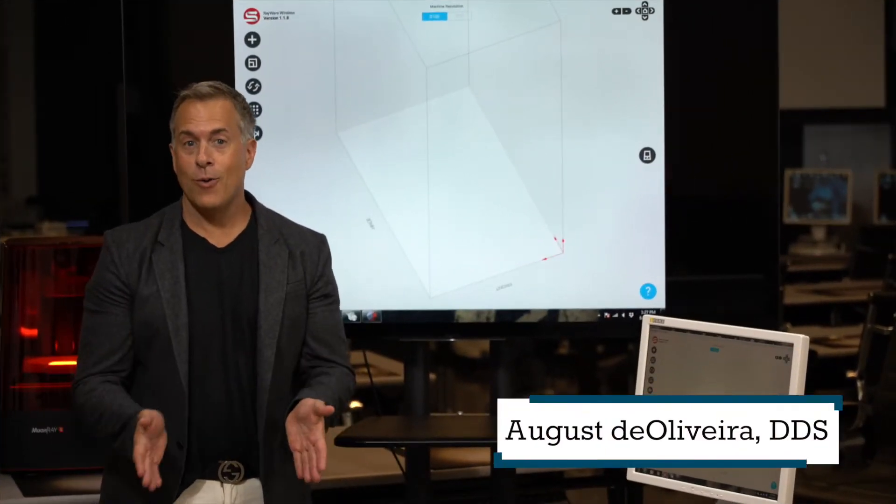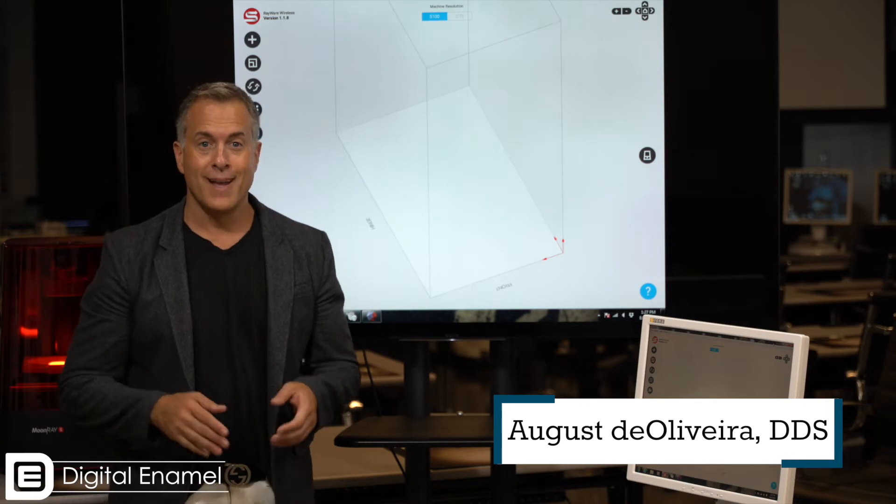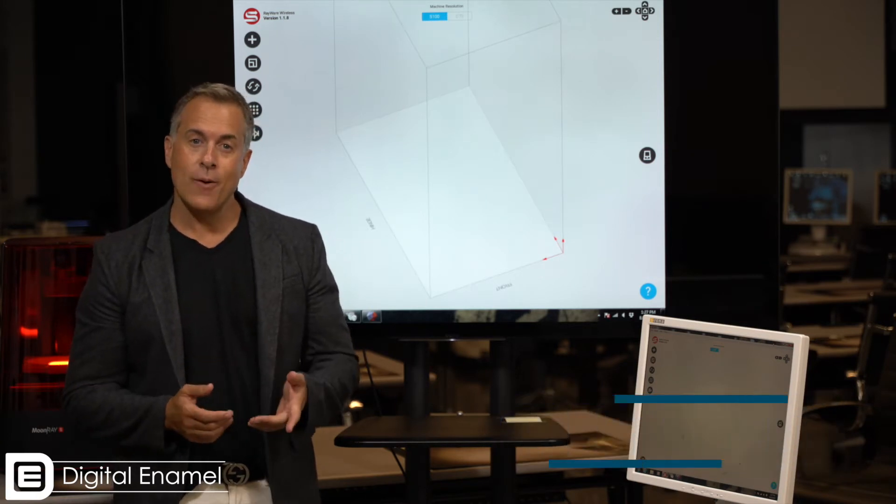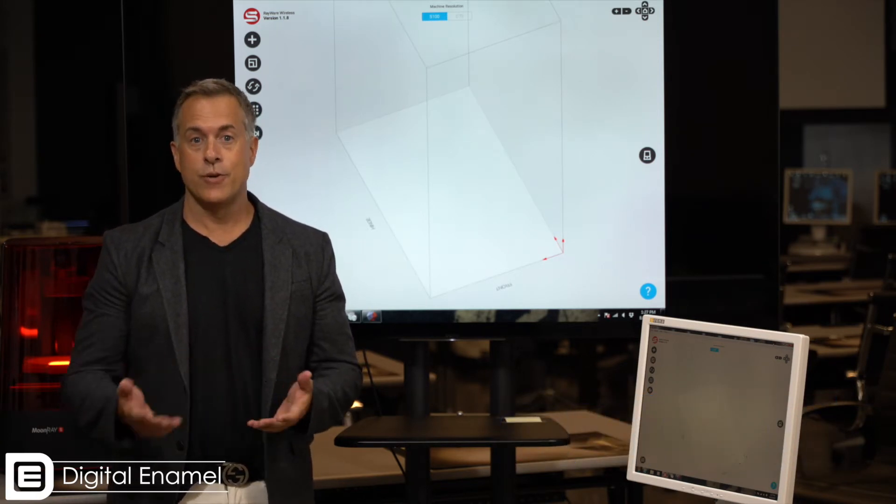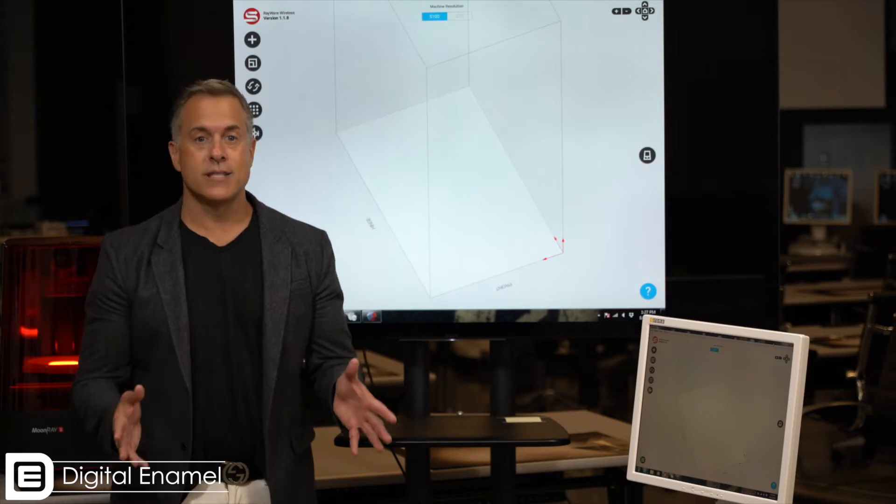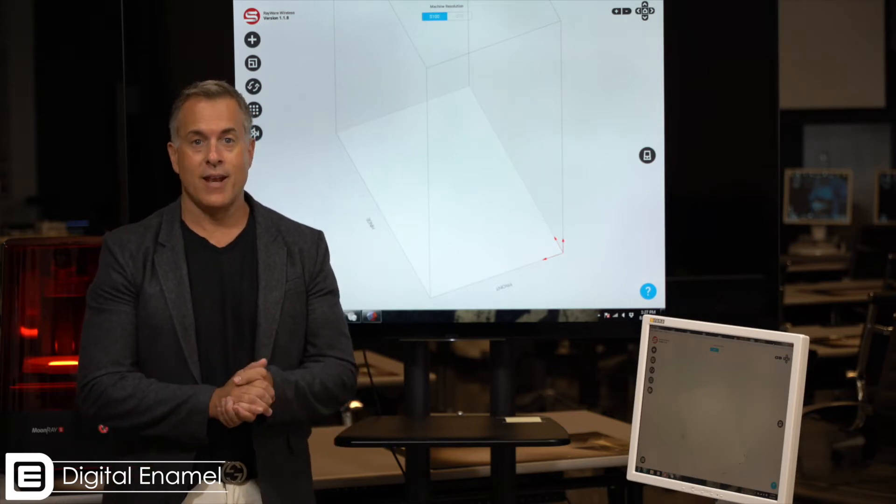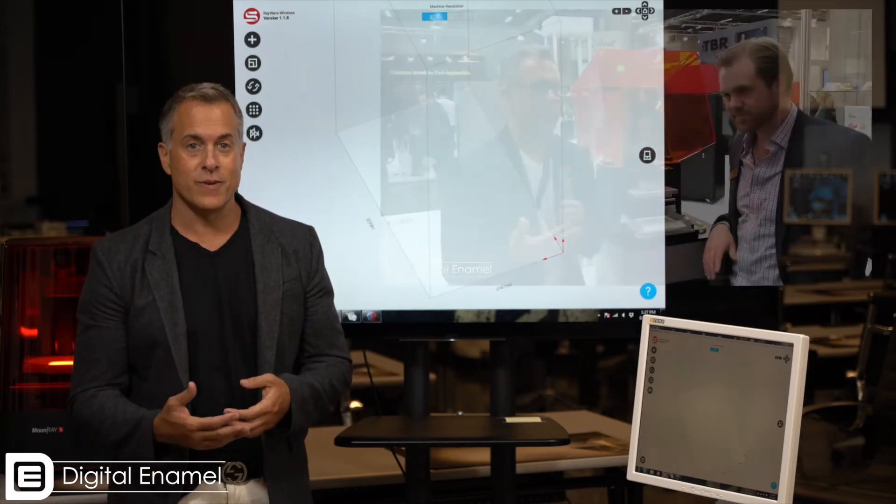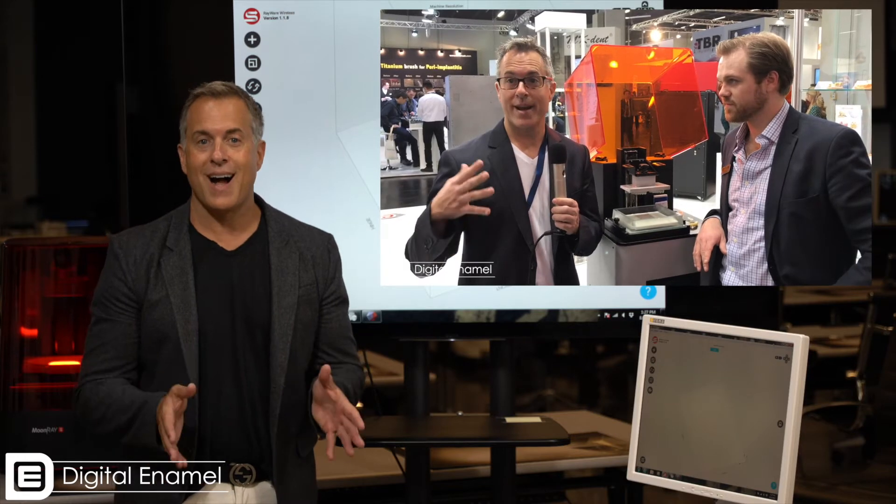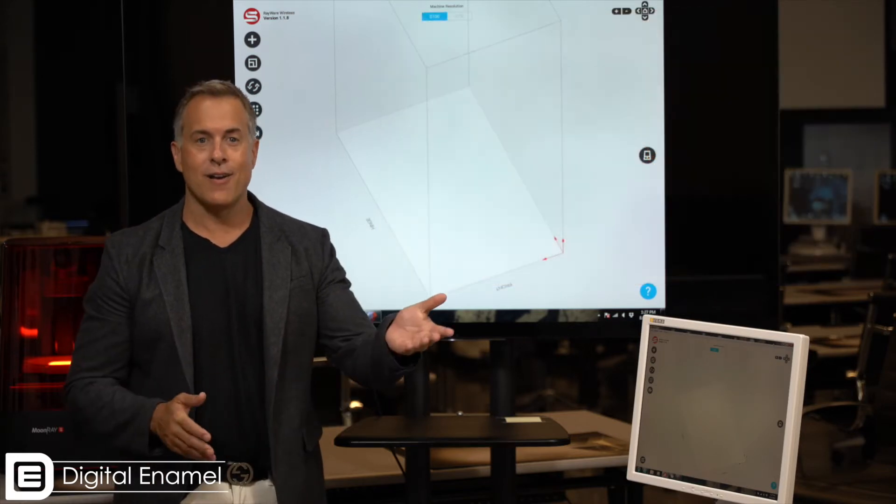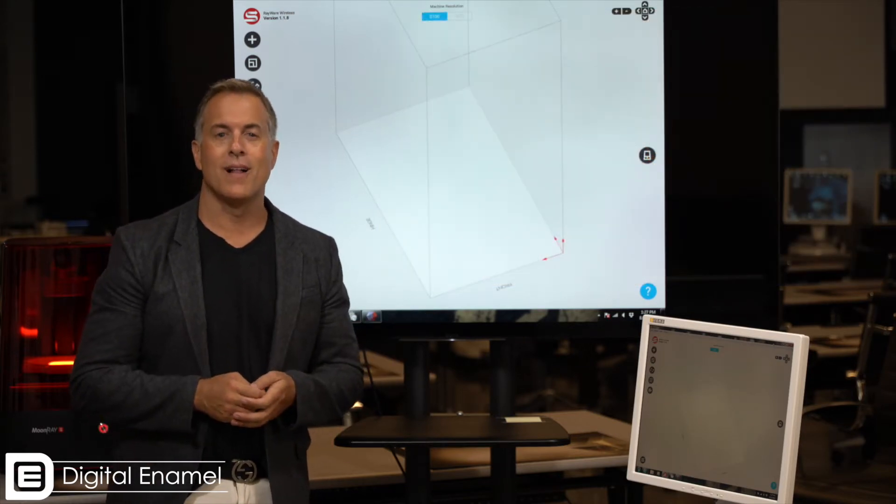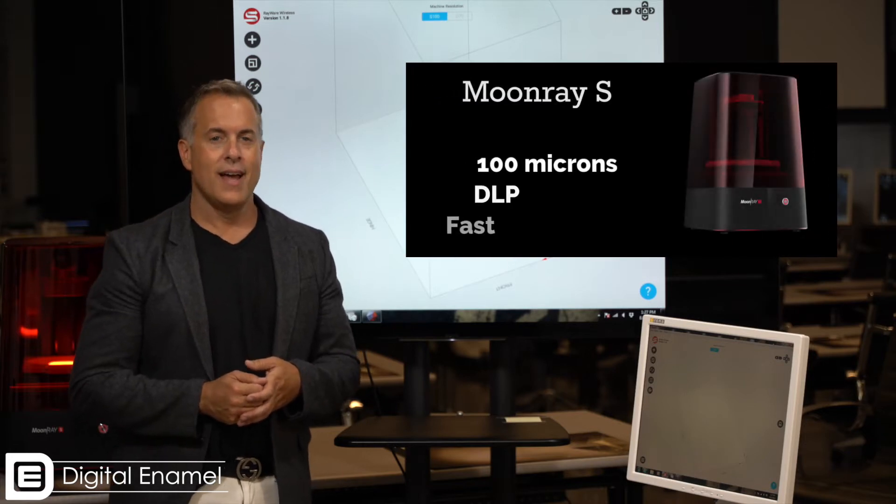Okay, so now we've exported our model. It is print ready and now we've got to go ahead and get it to the printer. There's lots of different printers on the market and you can see numerous videos we've shot at the IDS in Germany this year reviewing the different printers. But one of the printers that I just love, and Todd over here at Digital Enamel has one as well, is the MoonRay S.